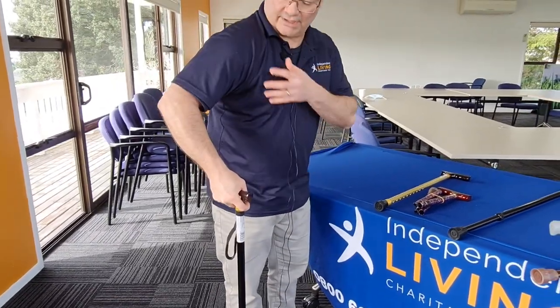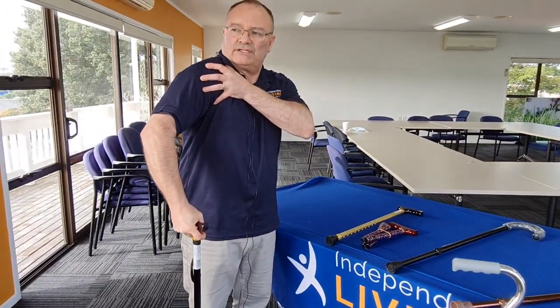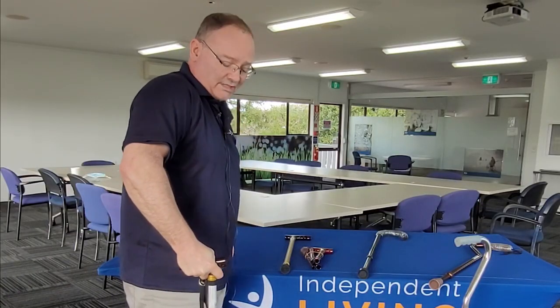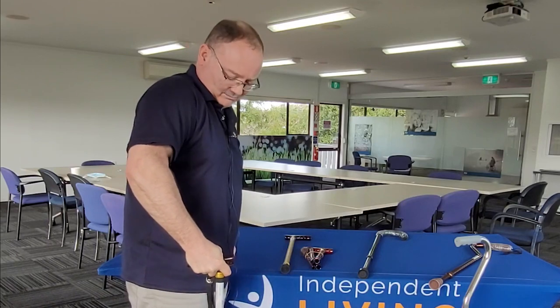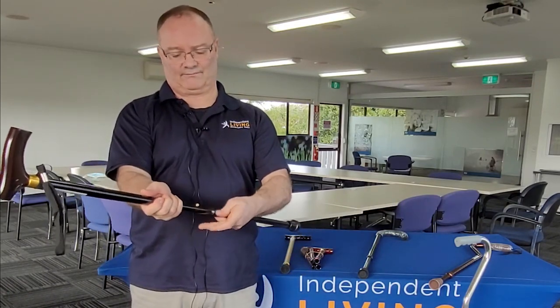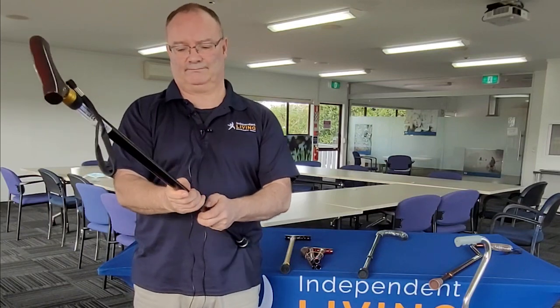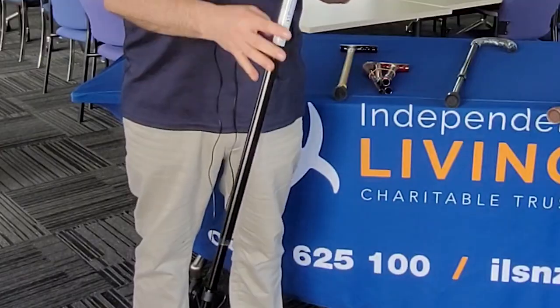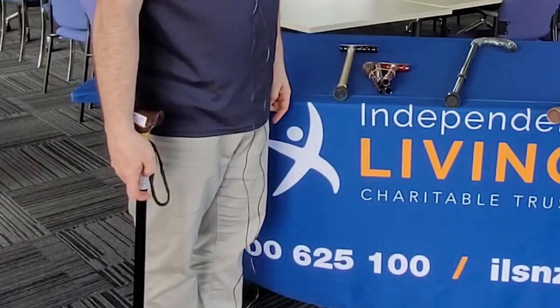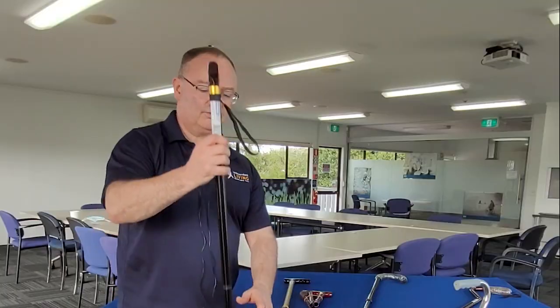This one is way too high for me, so as I try and use it you'll see I'm going to raise my shoulder joint. I do not have control of the stick, and a walking stick is a balanced device. So what I need to do is adjust the stick to my height, and I want the handle to fit to the inside crux of my wrist — so even now that's just a little bit too tall.